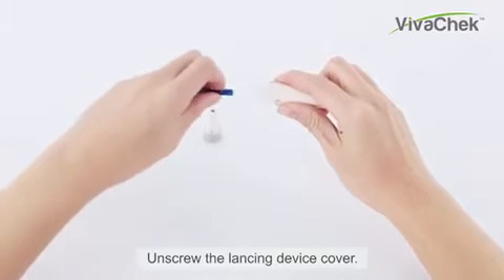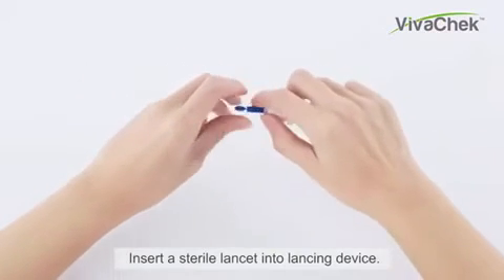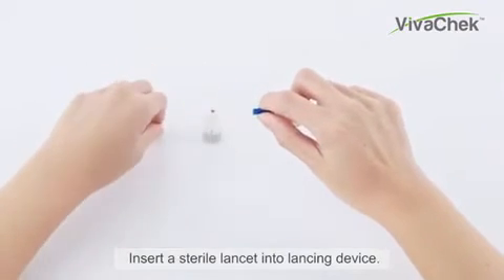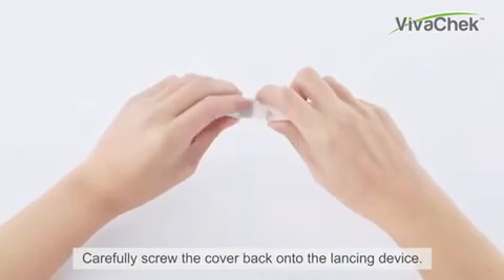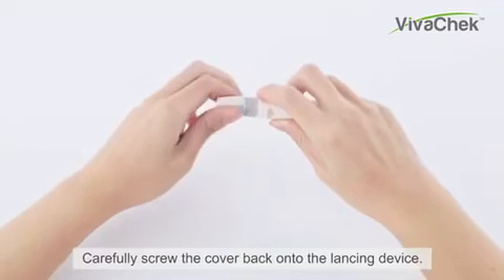Unscrew the lancing device cover. Insert a sterile lenset into the lancing device. Twist the safety tab of the lenset. Carefully screw the cover back onto the lancing device.